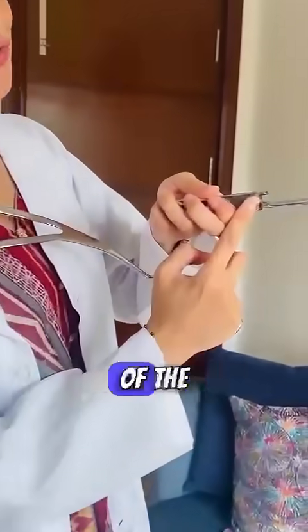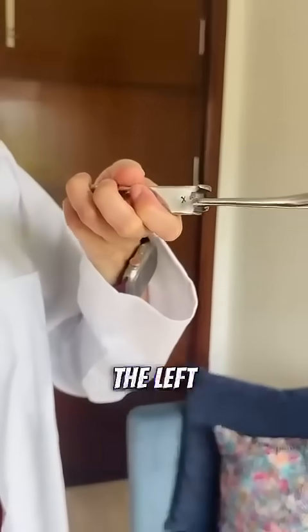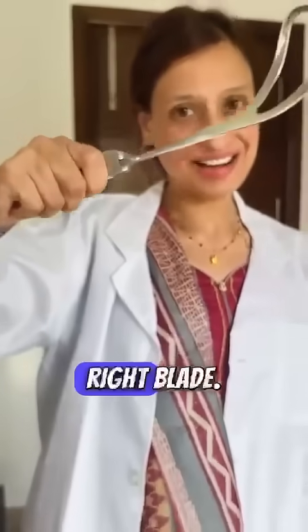Now jab aap inko correctly hold karo ge, in one of the blades the socket of the English lock is directed up — ye upwards hai. So this is the left blade. The left blade has to be introduced first. On the other side dekhye, the English lock ka socket is coming at the bottom side — this is the right blade.